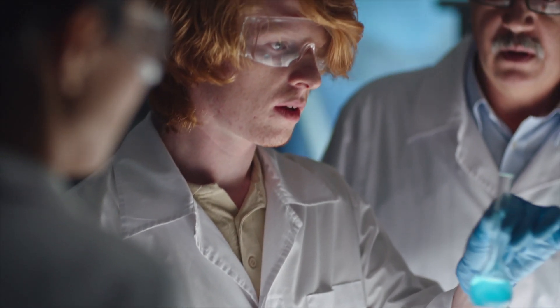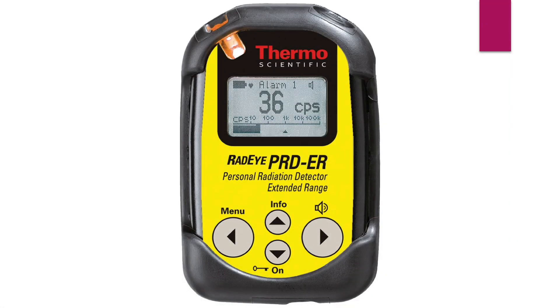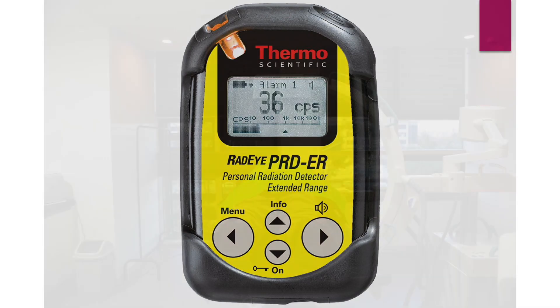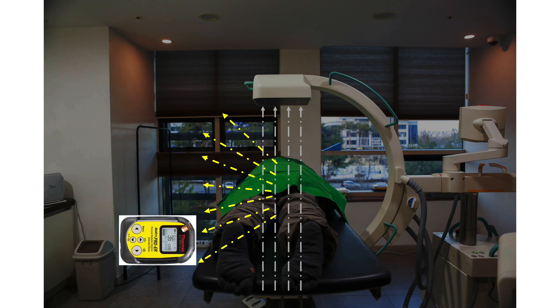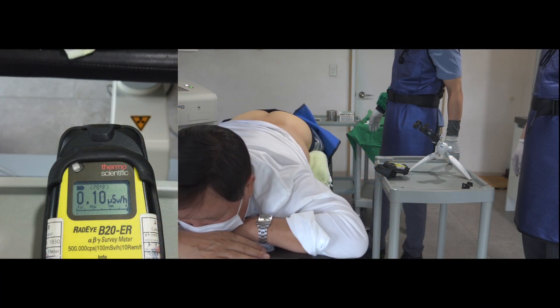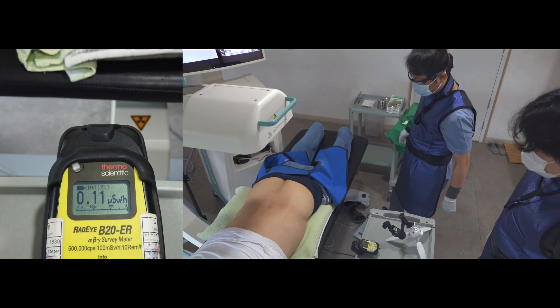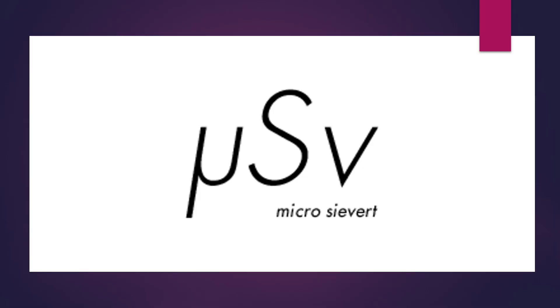From now on, I will prove the efficiency of my scatter drape. I used a Thermo Scientific personal radiation detector to measure the dosage of the scattered radiation. I measured dosages at three different levels: pelvic, trunk, and shoulder levels. I repeated this sequence on two other volunteers, moving the table step by step and measuring the dosage. The dosimeter was placed on a fixed table, and the unit of measured radiation was microsieverts per hour.